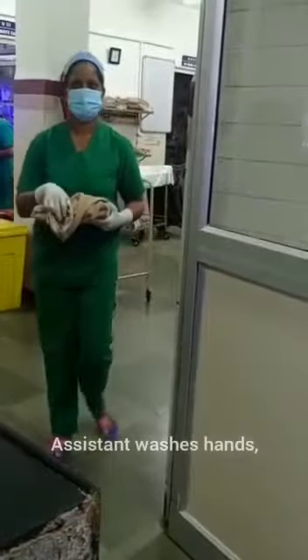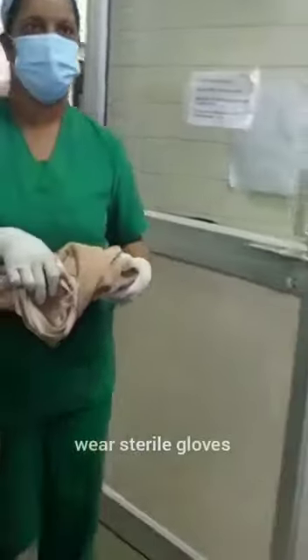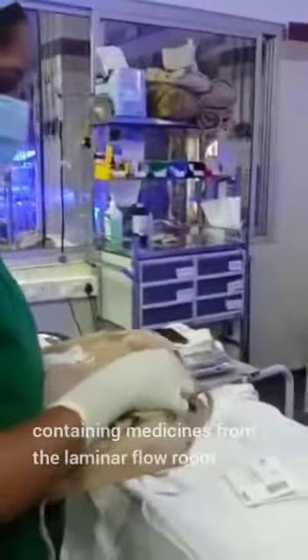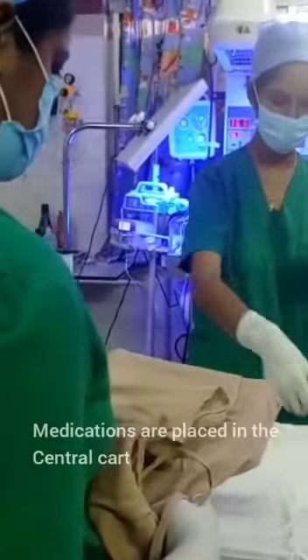The assistant washes hands, wears sterile gloves, and brings a sterile spray containing medicines from the laminar flow room. Medications are placed on the central cart.